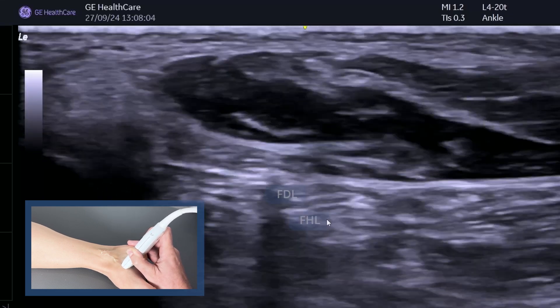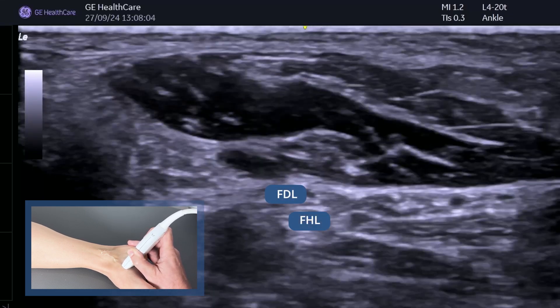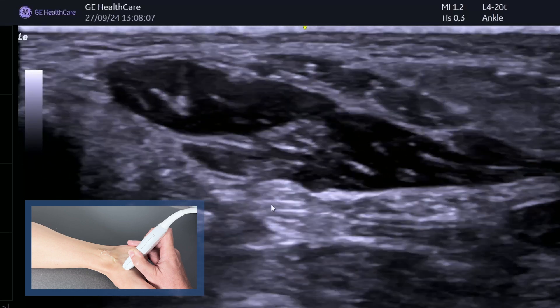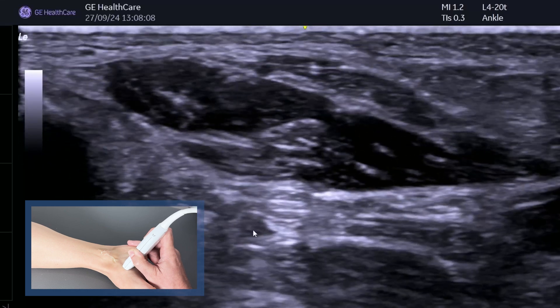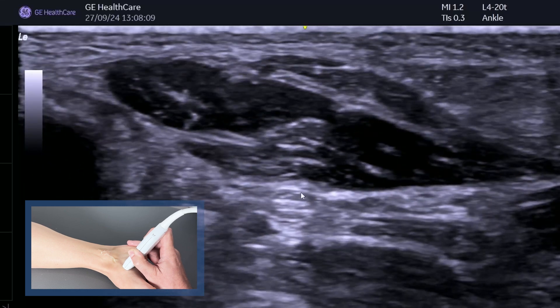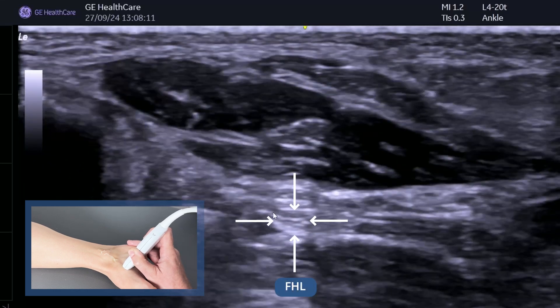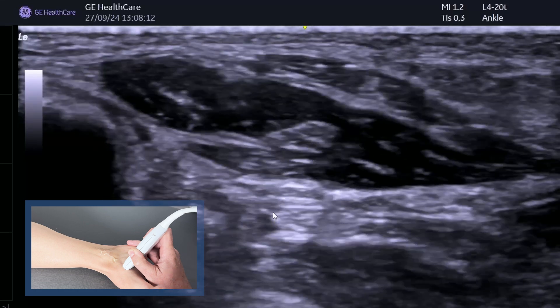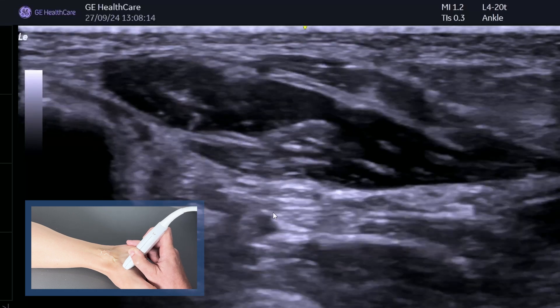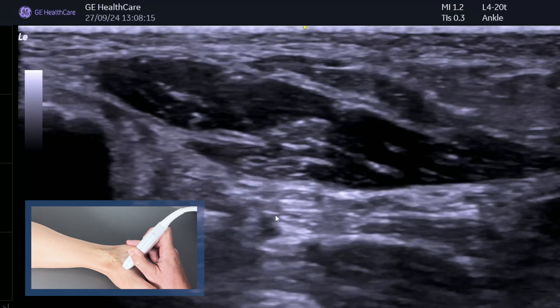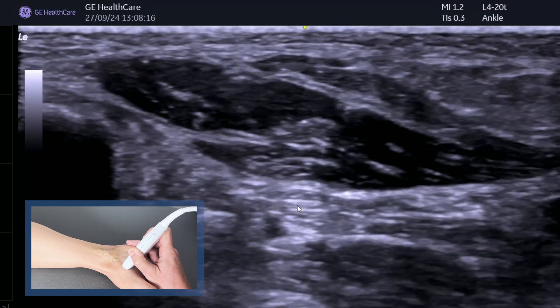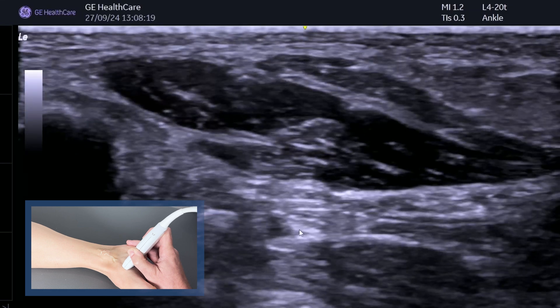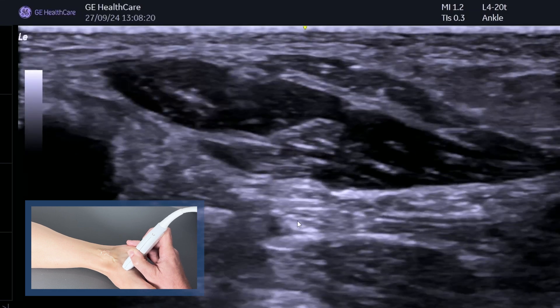FHL is now sitting underneath FDL. Can you see it almost looks like a bit of a coffee bean? If I just move the big toe, you can see the FHL tendon moving underneath. So on top we've got FDL, underneath we've got FHL. This is the knot of Henry.